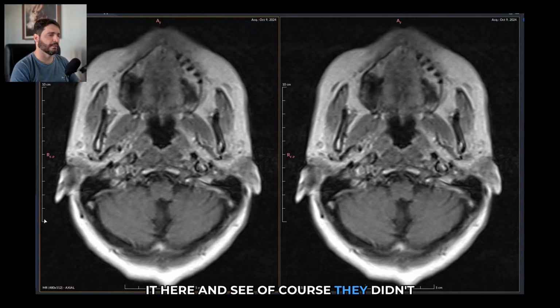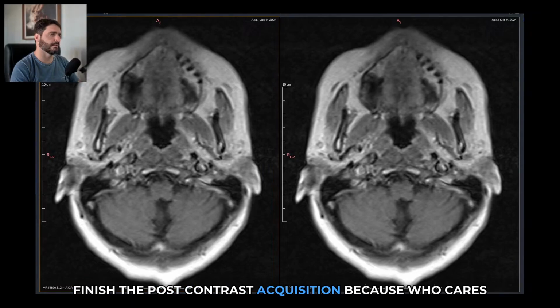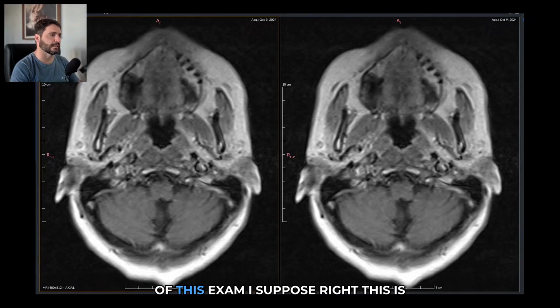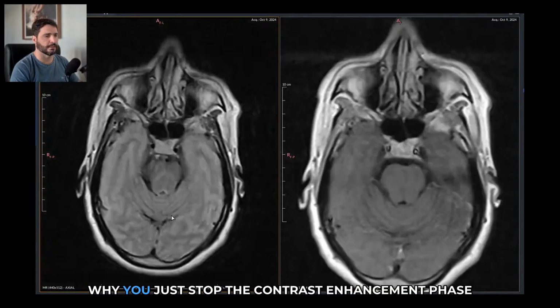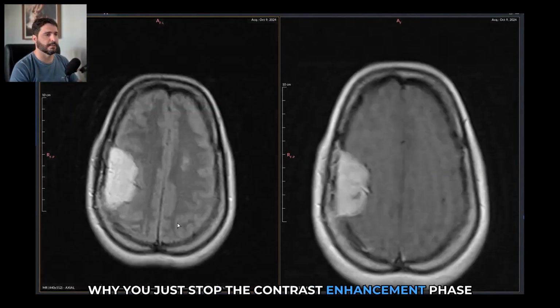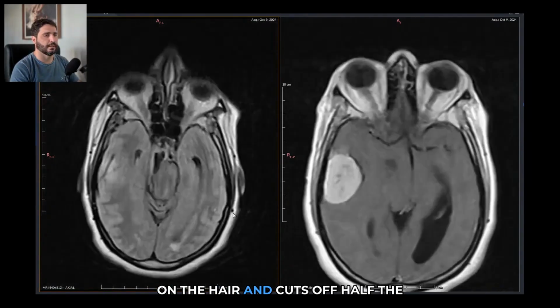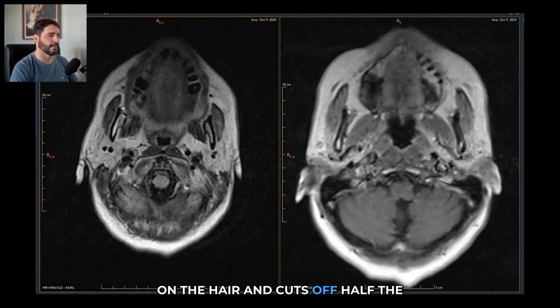Of course, they didn't finish the post-contrast acquisition because who cares about the cerebellum? Cerebellum isn't even part of this exam, I suppose, right? This is why you just stop the contrast enhancement phase at the hair and cut off half the cerebellum.